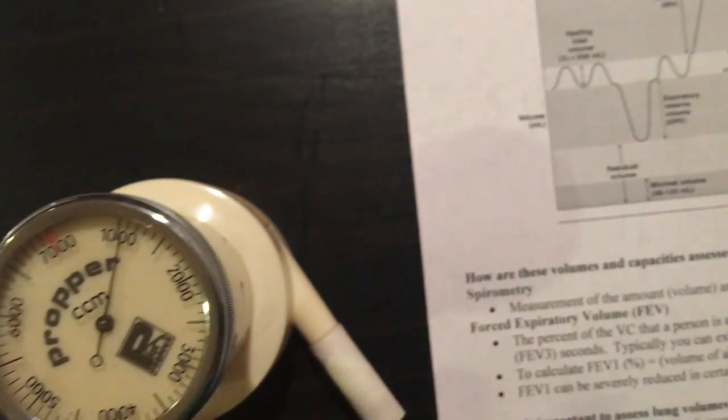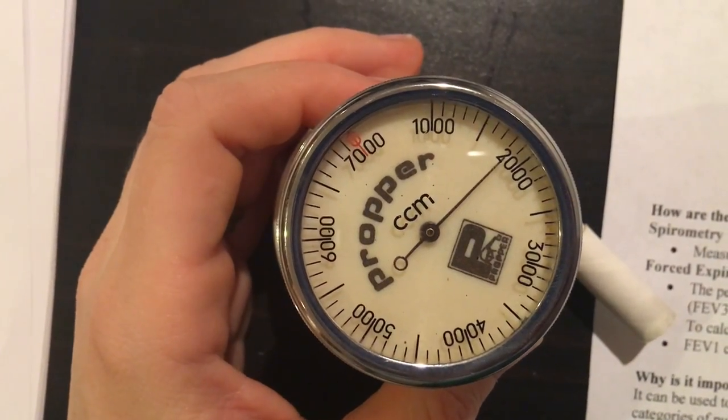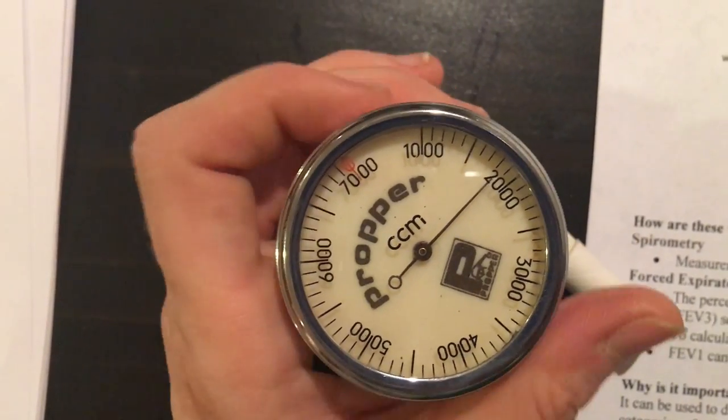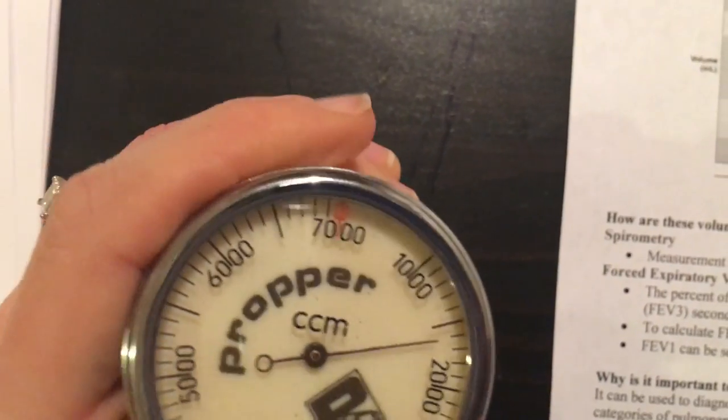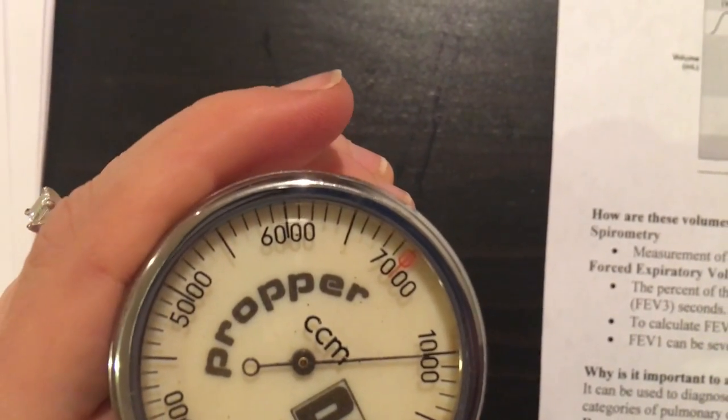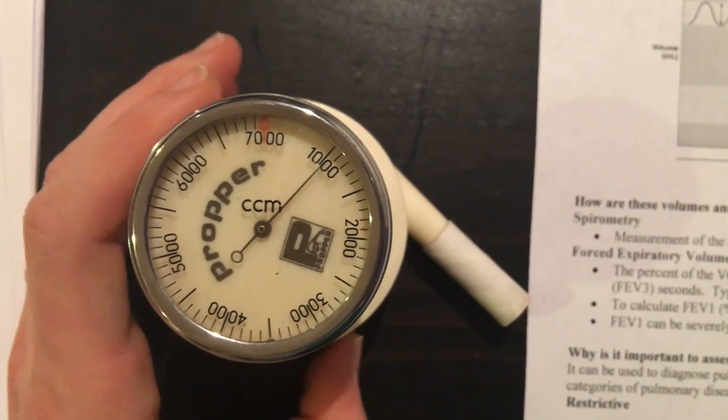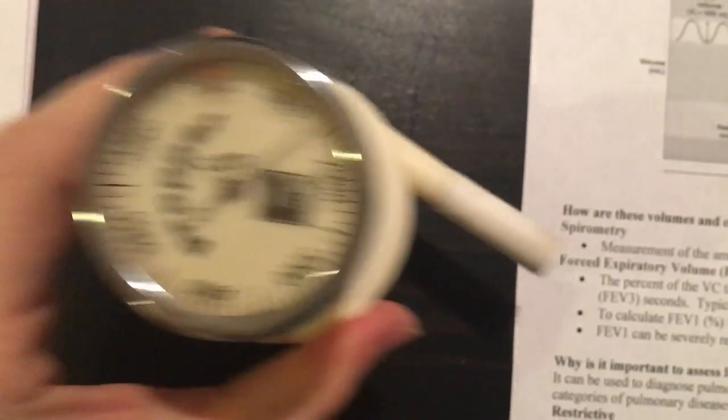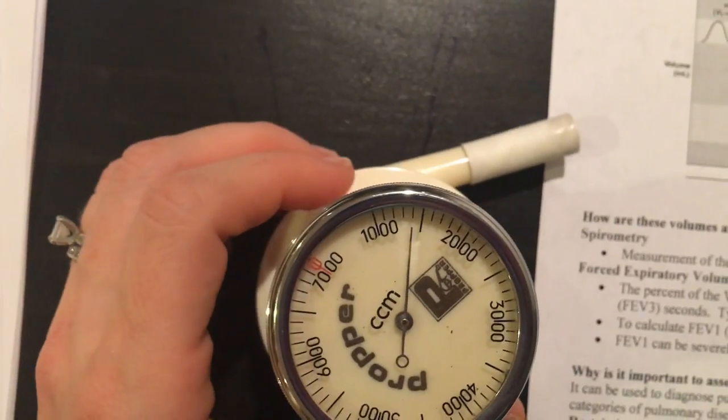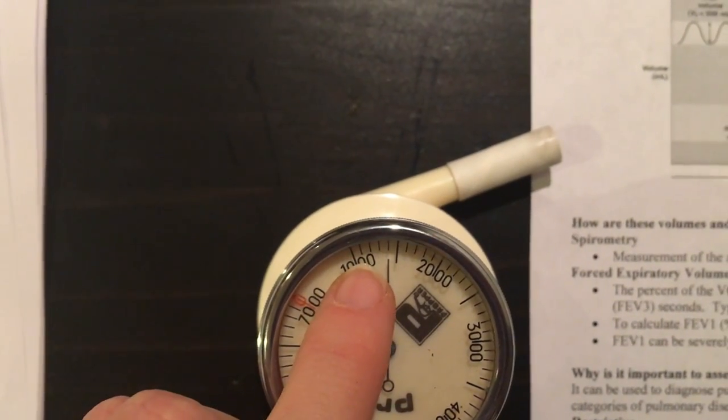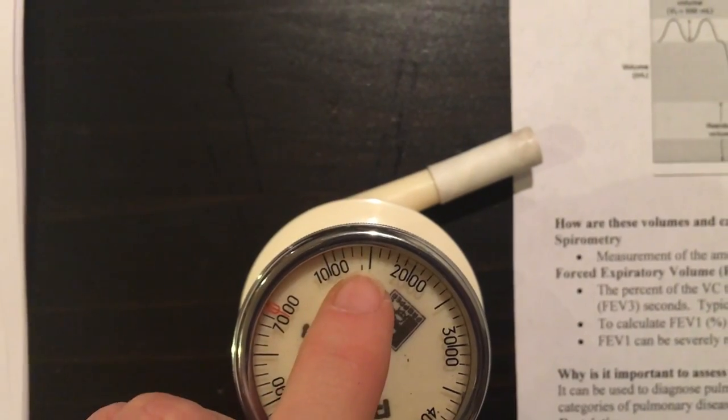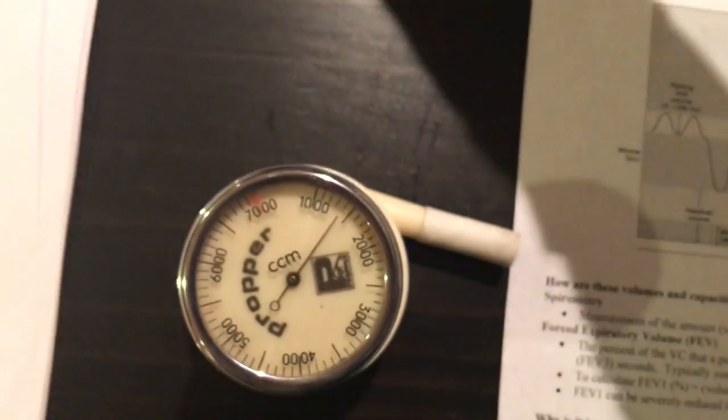Let's see what I get for tidal volume. Okay, that was probably too much. I probably breathed in a little bit too much. Let me try it again, try to do a quiet breath. Okay, better. This is going to be 100, 200, 300, 400 milliliters, so we are going to say that my tidal volume is 400 milliliters.